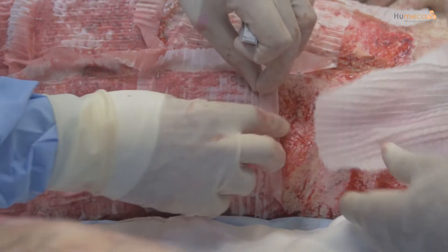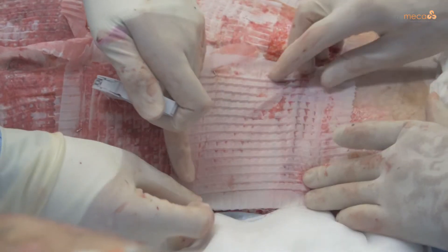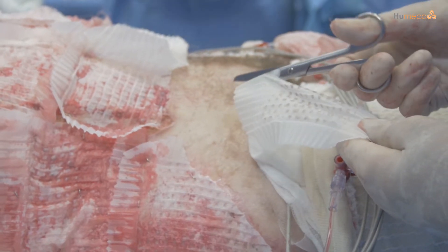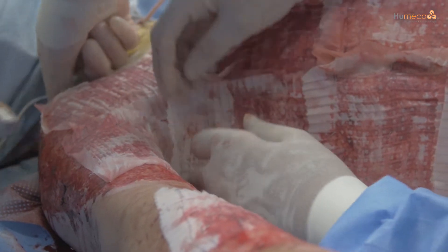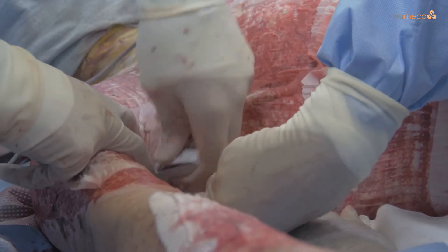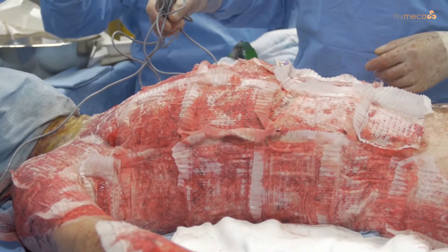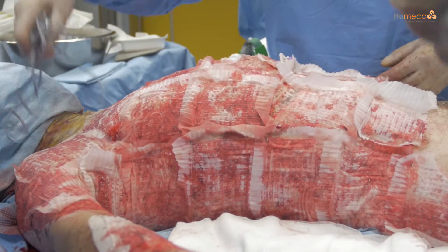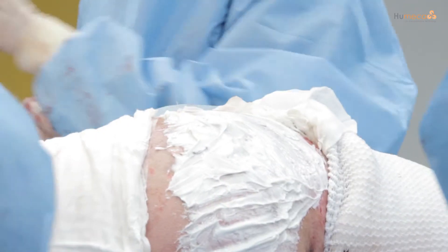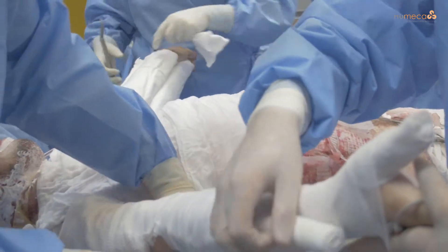Secure with staples and fold back the edges of the gauze. Gauzes should be placed close to each other and aligned to prevent additional scarring in between each one. The permeable nylon gauze also acts as a carrier for the graft and helps protect from shear. Gauzes can also be trimmed to fit difficult areas. The graft islands adhere very well to the gauzes and handling them is very easy — this is in contrast to the trouble in handling some widely expanded mesh grafts. All graft islands are correctly orientated to the wound bed in a regular pattern, and the distances between the islands are relatively small, showing fast epithelialization rates. Local therapy after the MEEK technique is normally no different from the therapy used when applying mesh grafts. In order to have the graft take well, the wound bed is kept moist with suitable outer dressings after transplantation.